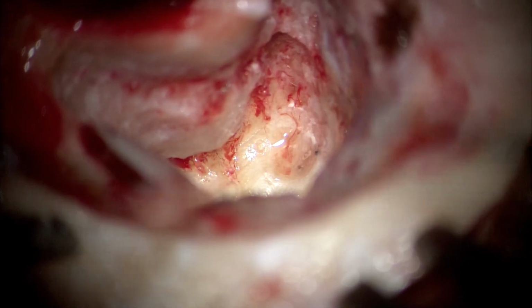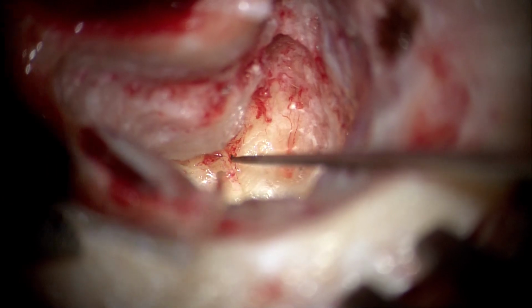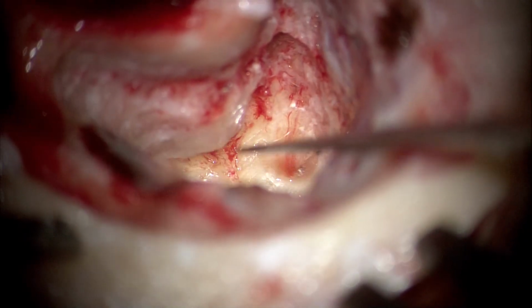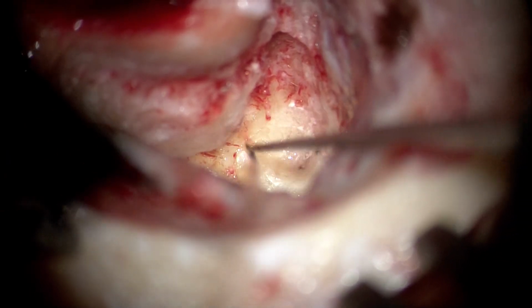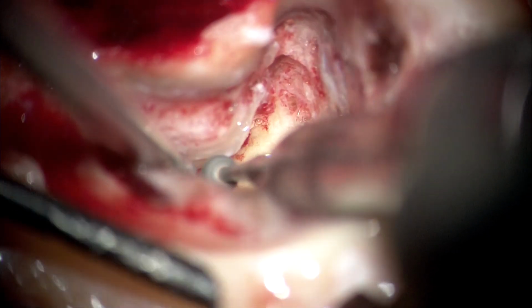Now we can resort to a very fine suction tip as well, which can go slightly inside the vestibule. You can see here how it is important to meticulously clean the entire vestibular epithelium, the neuroepithelium, which is the site of origin of the attacks of Meniere's disease.